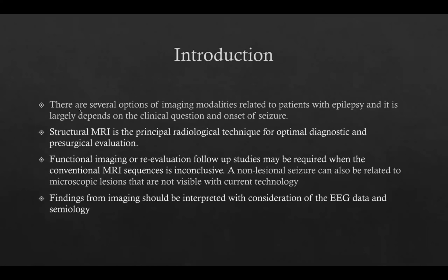So MRI would be the better option to look for structural causes for optimal diagnosis and also for pre-surgical evaluations. Apart from the conventional MRI, we also have functional imaging, which is useful to look for the metabolic changes related to epilepsy.